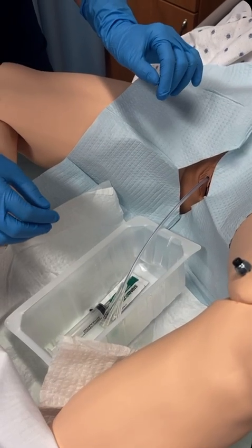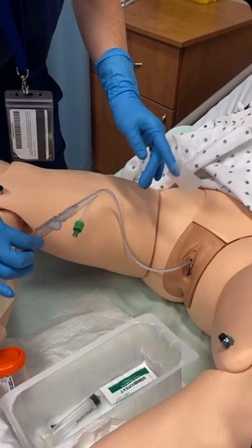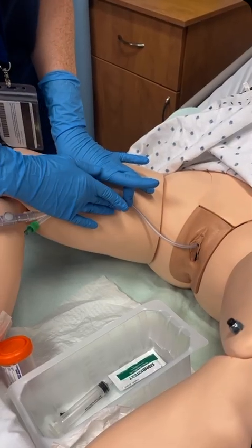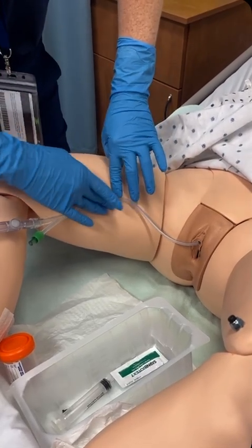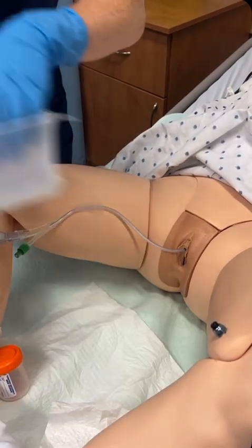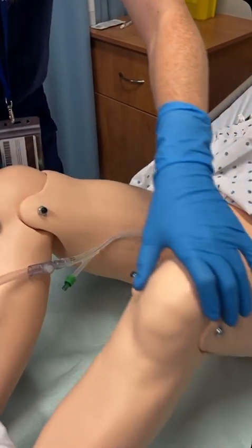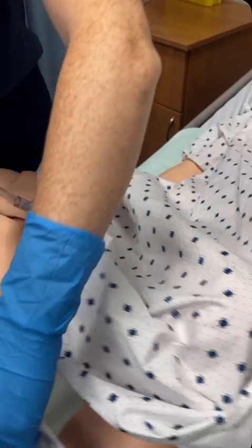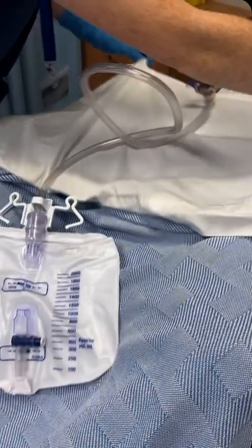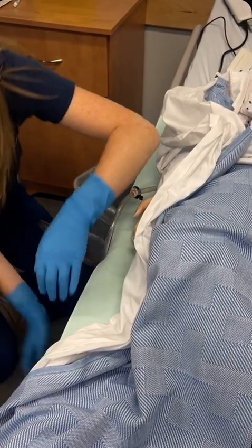For an indwelling catheter, test catheter by pulling back slightly. For an indwelling catheter, anchor and secure the catheter to leg using correct stabilizer device or uses tape, and assist patient and client into comfortable position. Cleanses the perineal area and lowers the bed and disposes of equipment.